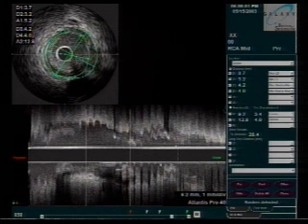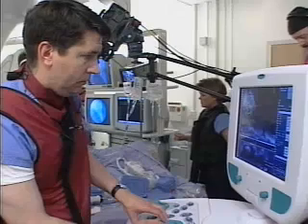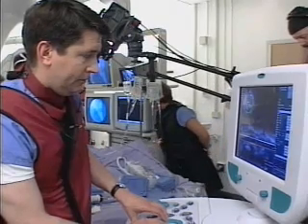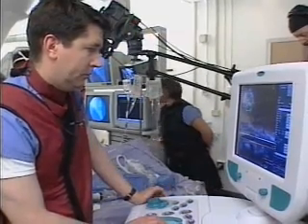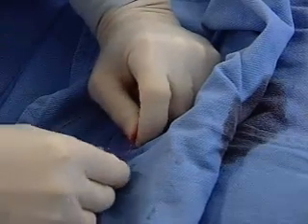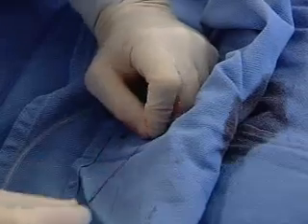So this is a pretty big vessel, and we are limited right now in terms of the sizes available of stents, the diameters of the drug-eluting stents. Right now we only have up to 3 millimeter diameters, but these stents can be expanded a little bit larger than that, up to perhaps 3.5 or even 4, and that's what we're going to be looking at doing probably in this case, now that you've told us that this vessel probably should be 3.5 to 4 millimeters.